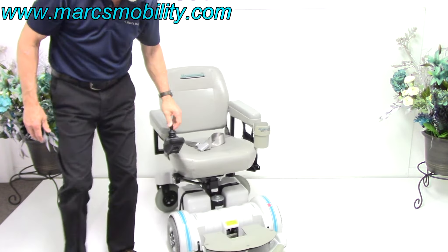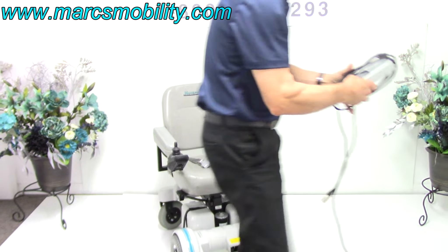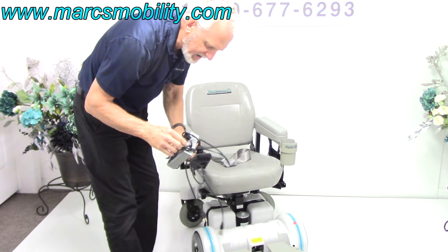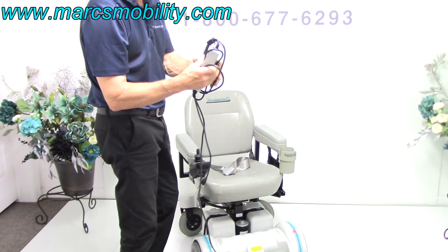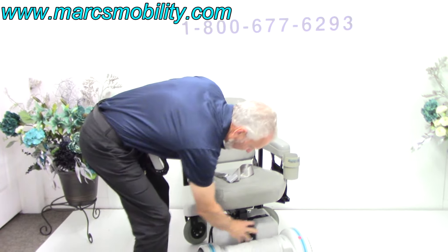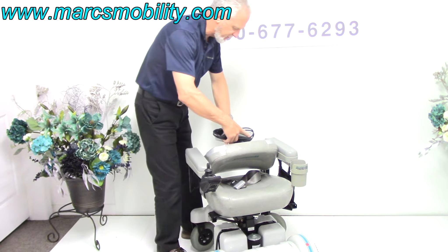When you charge this chair, you'll take your Hover-Round charger right here and plug it right below your joystick. As soon as the light goes from red to green, the charger shuts off automatically and your batteries are full. These are two U1 batteries — 35-amp batteries, U1, which is standard for this chair.